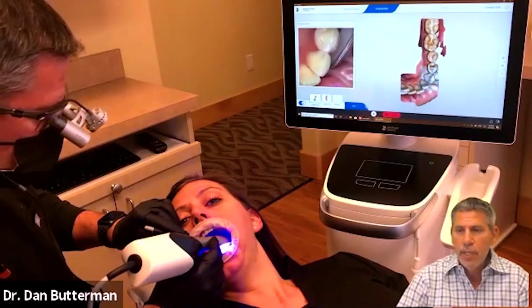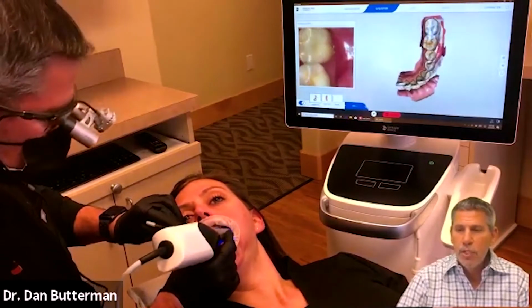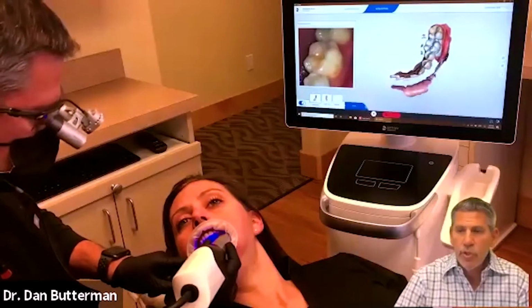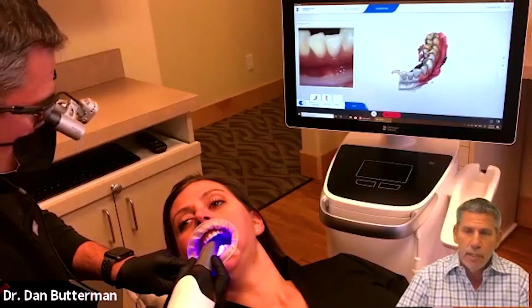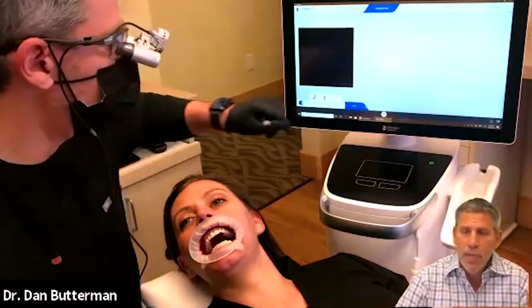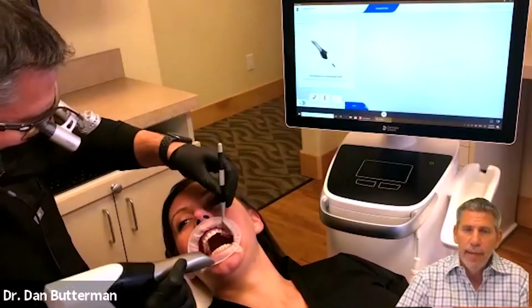And that's going to be captured, but I'll still do that same linear type of scan approach. It doesn't matter, because the software is basically looking at the number of images acquired. So if I now move the lip out of the way and I rescan that area, the software says, oh, it doesn't belong here. There are more images without the lip than with the lip, so it'll just take that away. And then finally, for acquiring the buccal bite, quite simple.